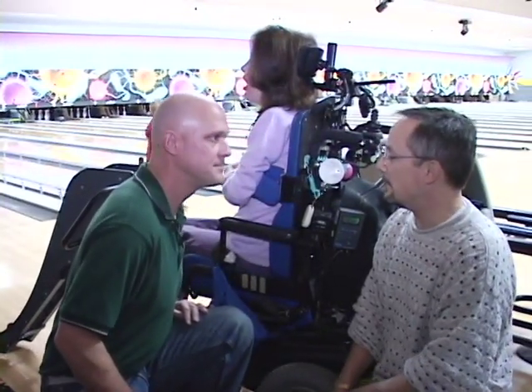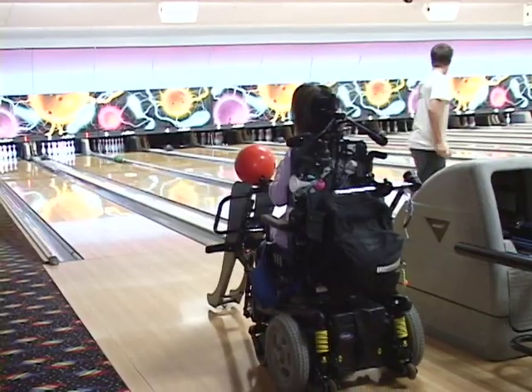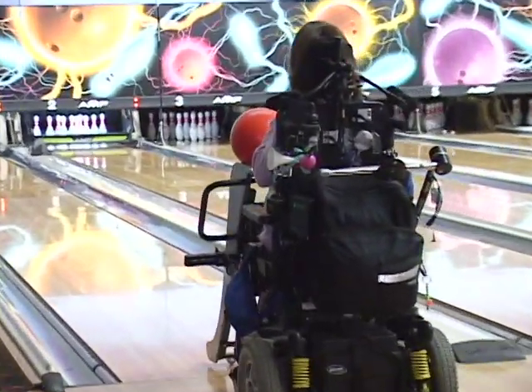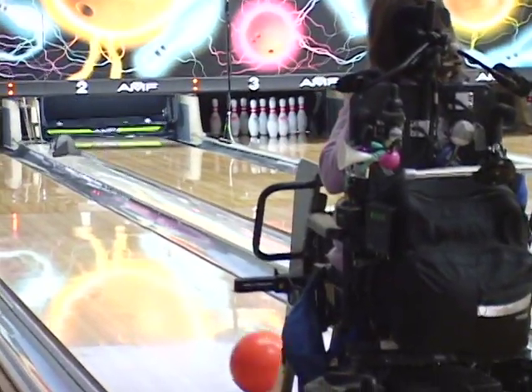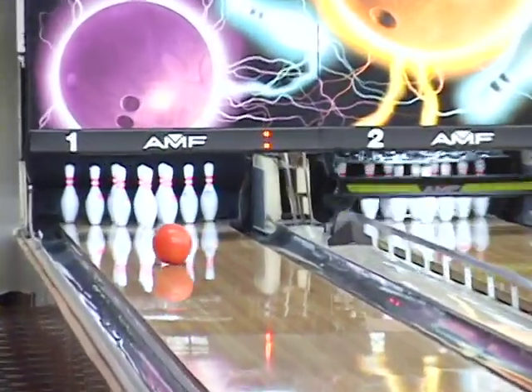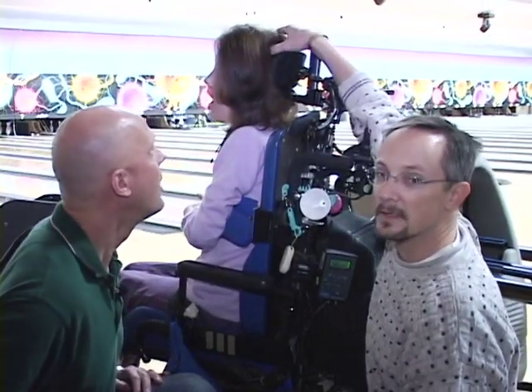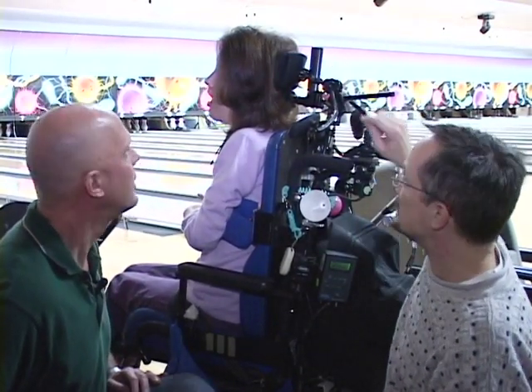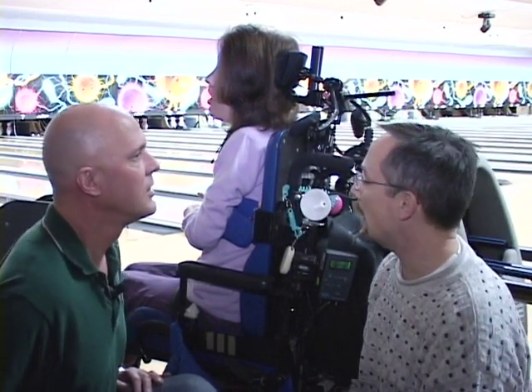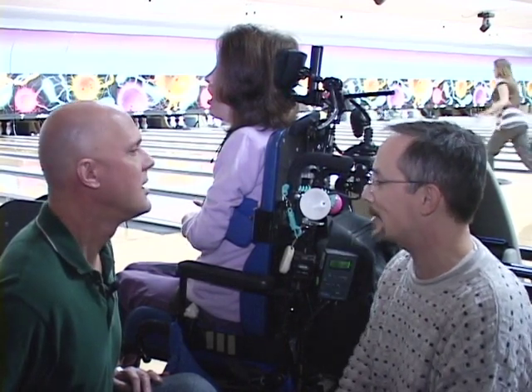She can. Now, she can run the chair, or you can run the chair. Victoria's chair can be driven either by an attendant, and so I can drive and help her get lined up, or she can drive it herself if we set it to the proper mode, and then she's the one that actually drives the chair down towards the pins. And how is she driving the chair? Victoria drives her chair with her head array, so she uses this pad here to either go forward or reverse, and when she's driving her own chair, she uses the side pads to turn. But right now, she can't quite do the side turning, so we just allow her to drive towards the pins.